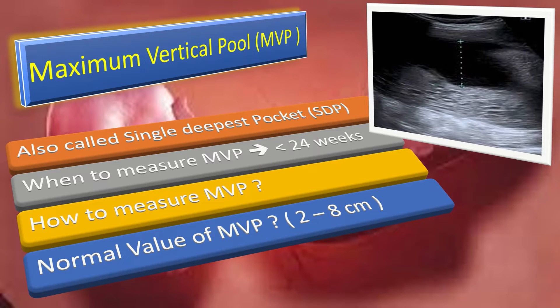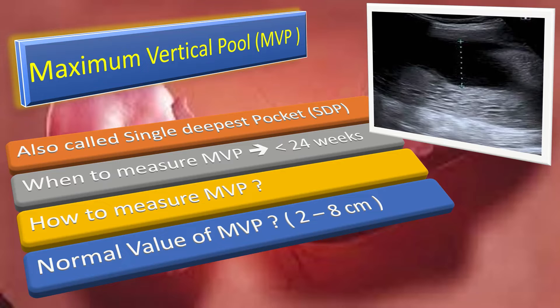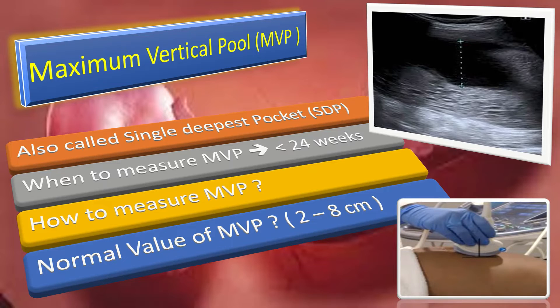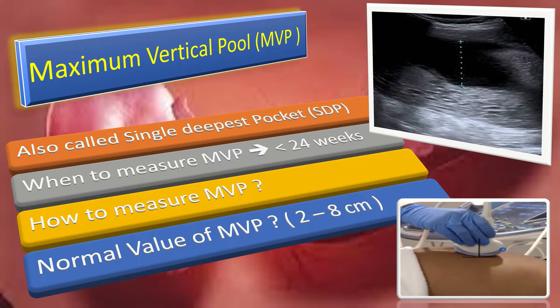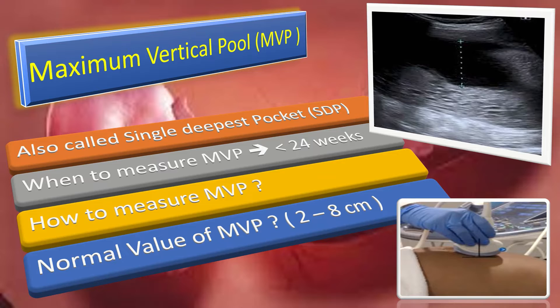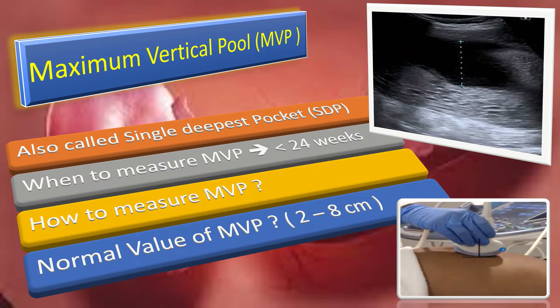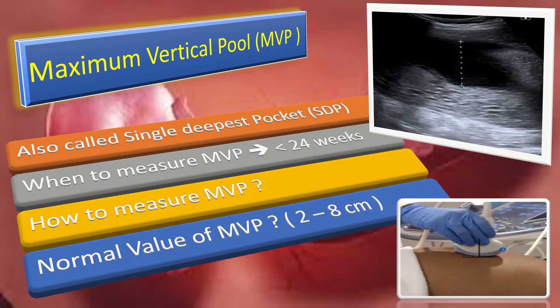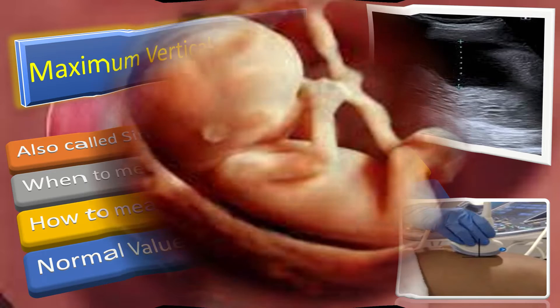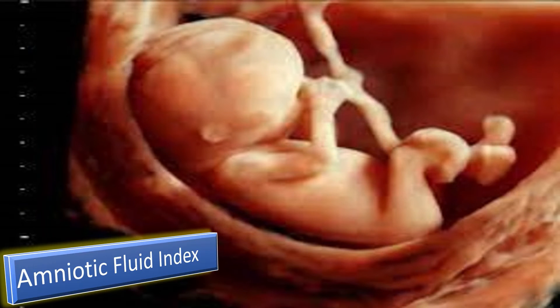Measure the greatest dimension with the ultrasound transducer perpendicular to the uterus. The normal value of maximum vertical pool is 2 to 8 centimeters.